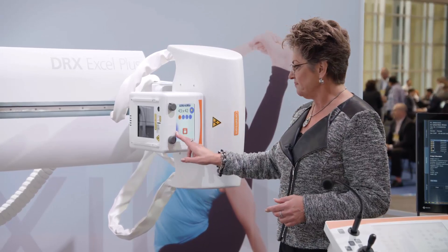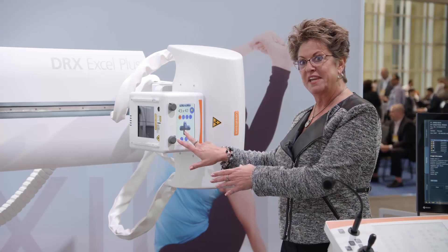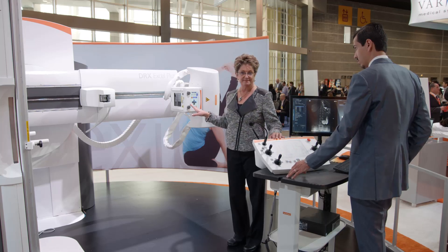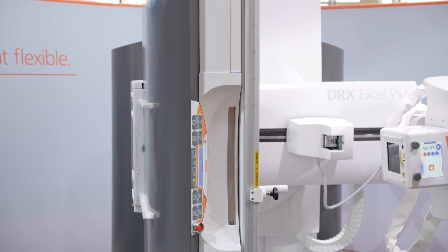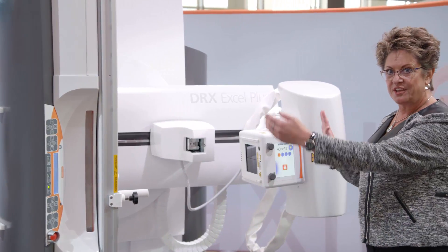Very simple movement. Again, access at the tube head, flexibility of working from here or the console. The majority of the time, our 43 by 43 detector and tube are tracking each other continually.